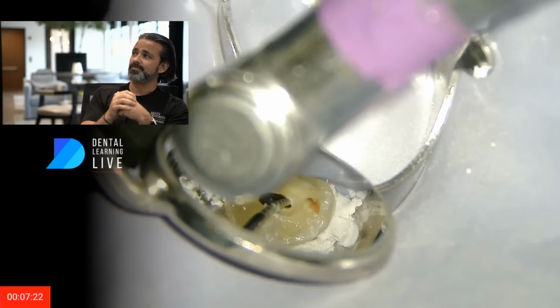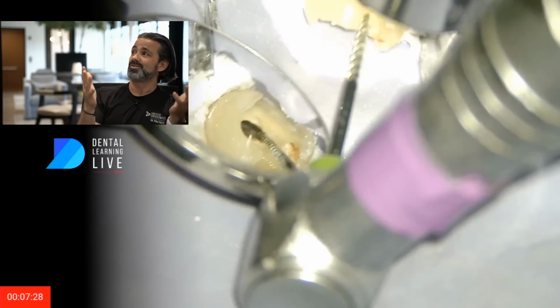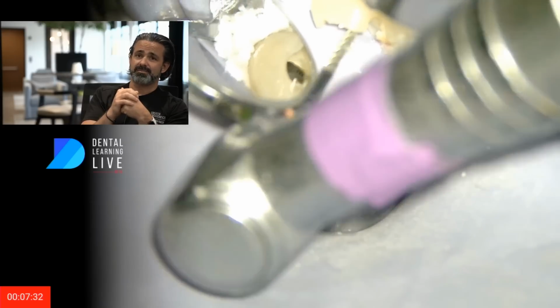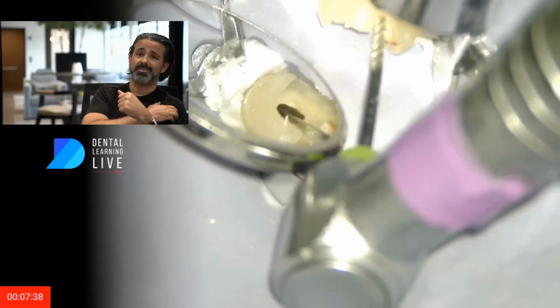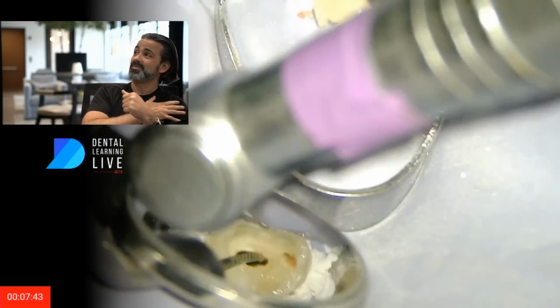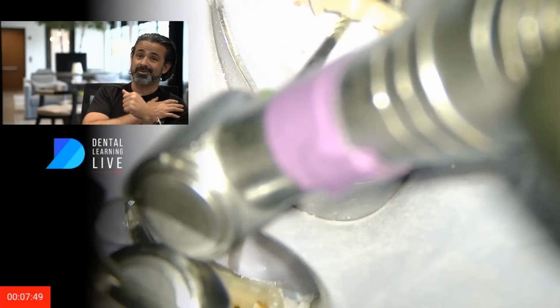Now, I guess this actual working time is not anesthetic in working time because I started this when I sat down. So I'm going back to that 1506 and I put a little bend in it, just like how we pre-bend hand files, and you can certainly hand file it too. I'm just trying to see if I can get it to bite, because if I can get it to bite with this, I can feather it up, like paintbrush stroke it up and get it to open up and then make my life easy. And right now I'm not so successful at it. It's a bit of a struggle. Life is real, you know. So I'm going to be picking around for a bit.